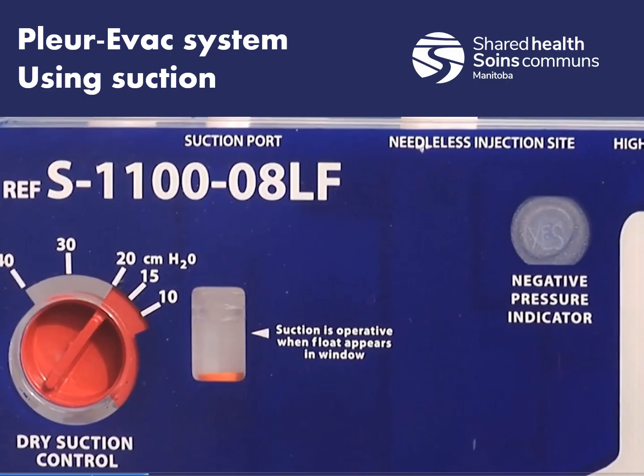Sometimes it is possible to see that negative pressure indicator, the yes, pop up when patients are breathing, just through changes in thoracic pressure. Again, look for patterns. If it's coming and going with their breathing pattern, that could be totally normal.